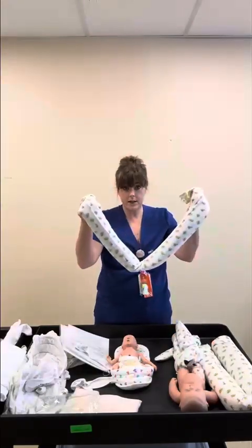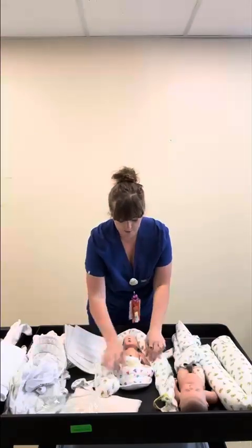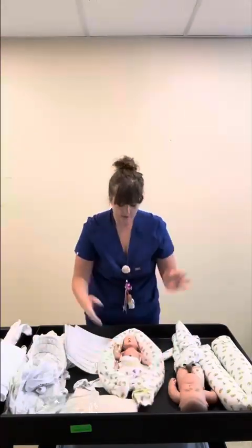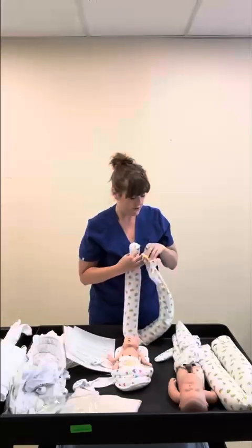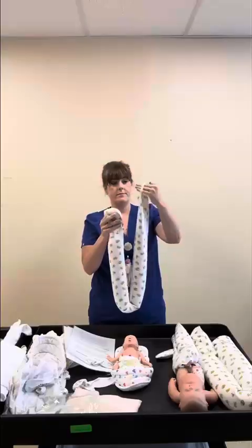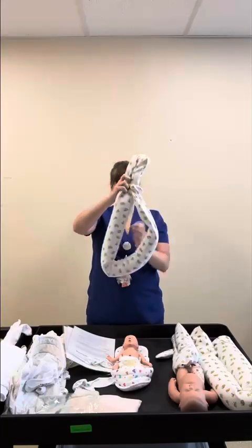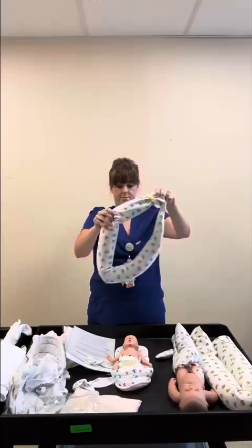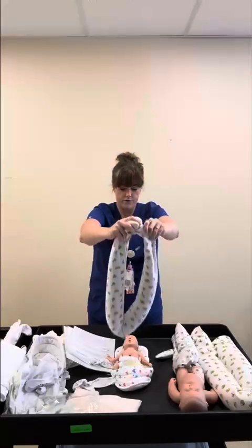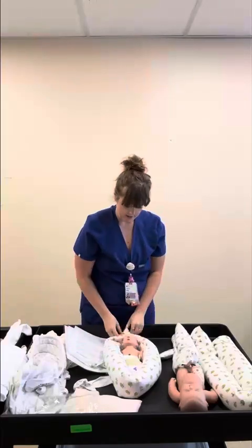You can also utilize these snakes, that's not the correct term, I'm so sorry, to provide that boundary around. Each of them, we have 2 different sizes, has this little special hook fabric piece, and that allows you to make a whole oval with the piece instead of just a U. So if you feel like they would benefit from that 360 degrees, that will help you keep it in place.